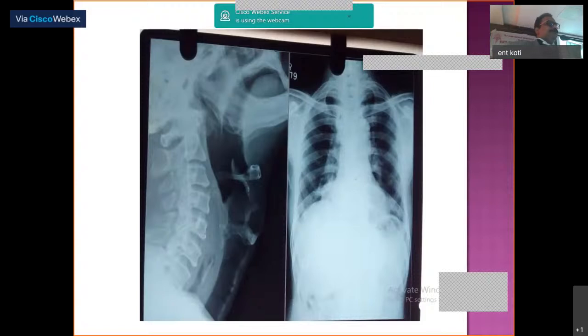So, retropharyngeal abscess going into an abscess. Okay. So here, see the digital X-ray, how nicely you are able to see structures like the epiglottis, the hyoid, the base of tongue, the thyroid cartilage, the retropharyngeal space, and the foreign body.